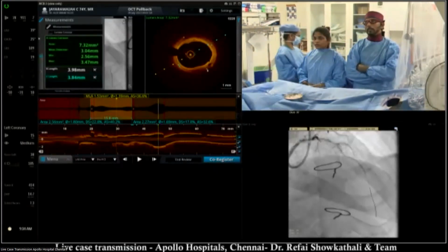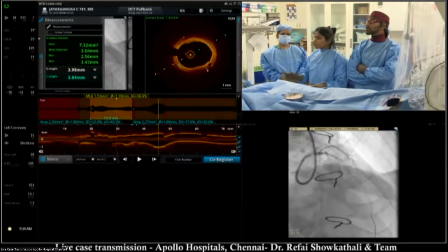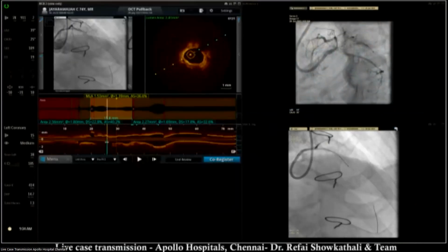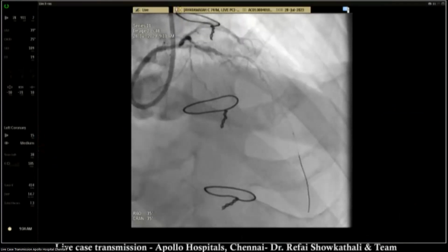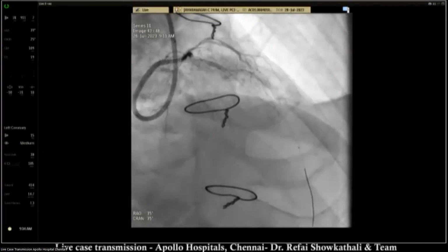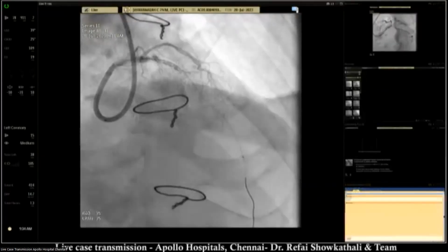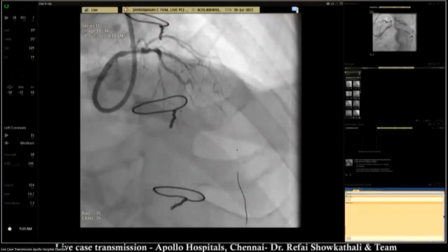Refai, can you tell them to show OCT on a bigger screen? Just one bigger screen, please. Can you show the OCT on the bigger screen? Just the OCT alone. The whole screen should be OCT, not the side fluoro. No images, no photo of Refai, only OCT. I don't think they are showing it. Is it the profile pictures now? Just OCT pictures.